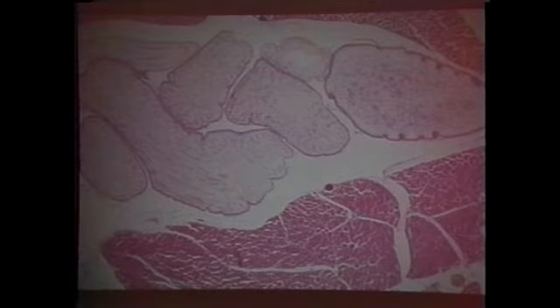All right. This is the multilocular type. It kind of goes through like a cancer. It doesn't have that big laminated wall like you've seen before. But certainly it has aggregates of protoscolices like we saw in the unilocular. And then you have the intermediate form, which is Echinococcus vogeli, sometimes Echinococcus oligarthrus. You have somewhat of a laminated outside, but then you have little septa, like you would have seen in the multilocular cyst. And this was only recognized about 5 years ago.